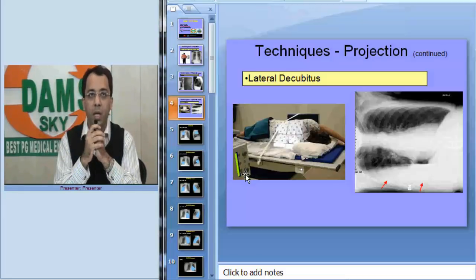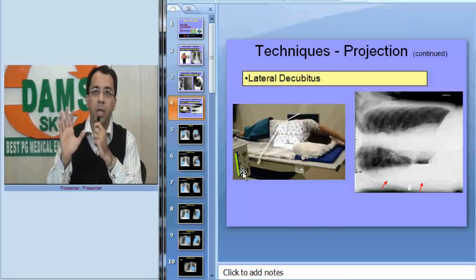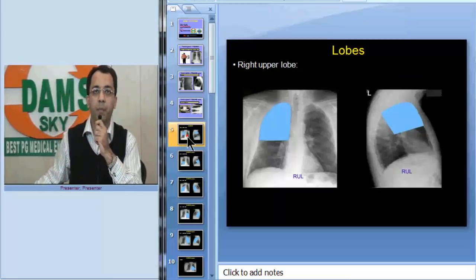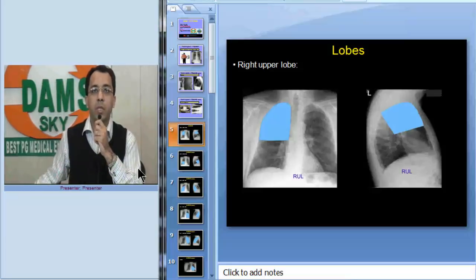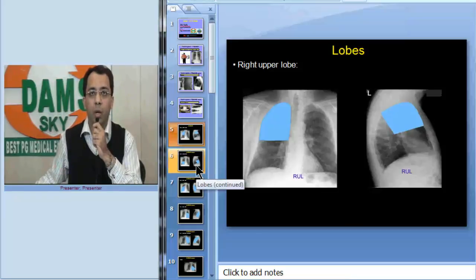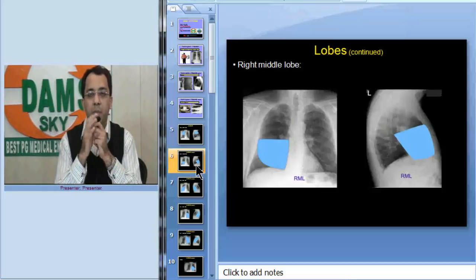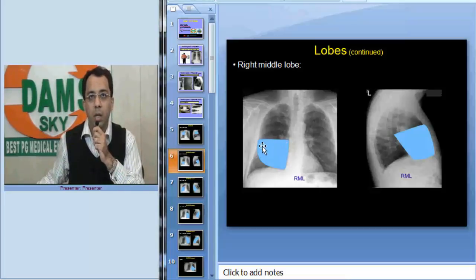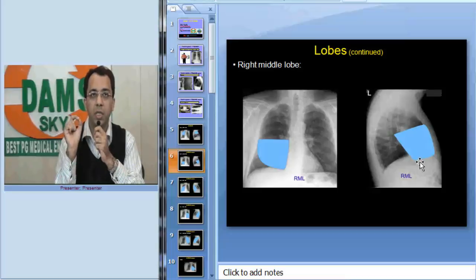Now let us look at how the lobes of the lung are seen on a chest x-ray. I will take a PA view and a lateral view side by side to show you how they are placed anatomically. This is the right upper lobe, seen on a PA view limited by the horizontal fissure. On the lateral view you can identify the trachea, aortic knuckle, and diaphragm. The middle lobe is abutting the cardiac silhouette on the PA view and is placed anteriorly on the lateral view.